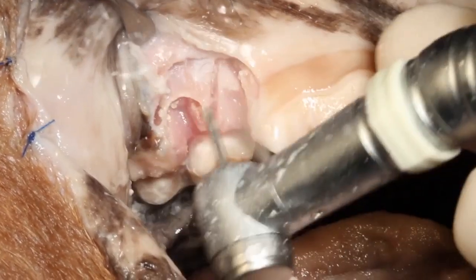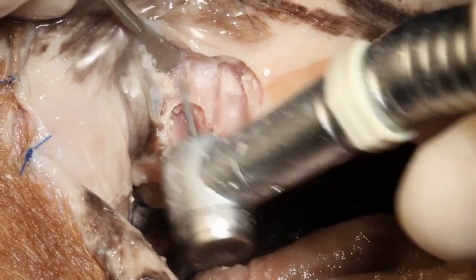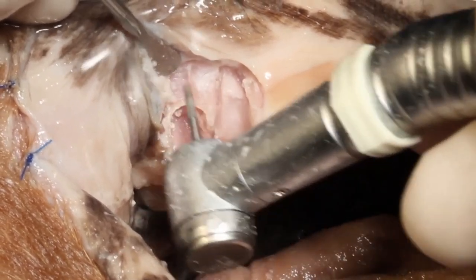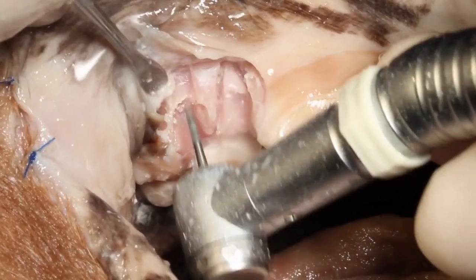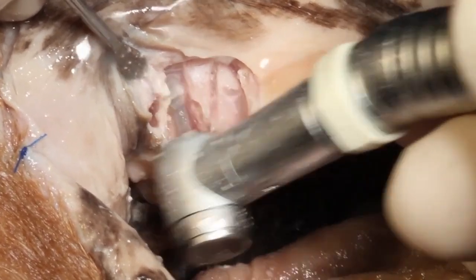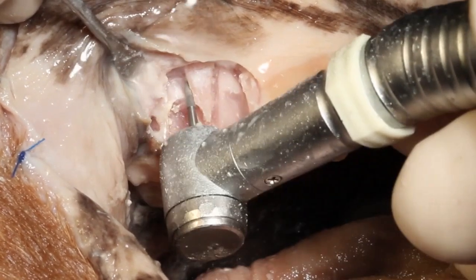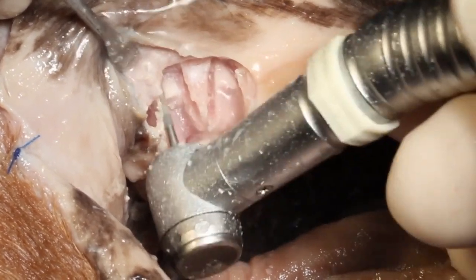Here's the technique where we use a burr to paint over that vestibular bone until the root tip comes into visualization. Then we create grooves mesial and distal in the bone — just like we did on that mesial root and on the coronal portion of those roots — in order to facilitate extraction.